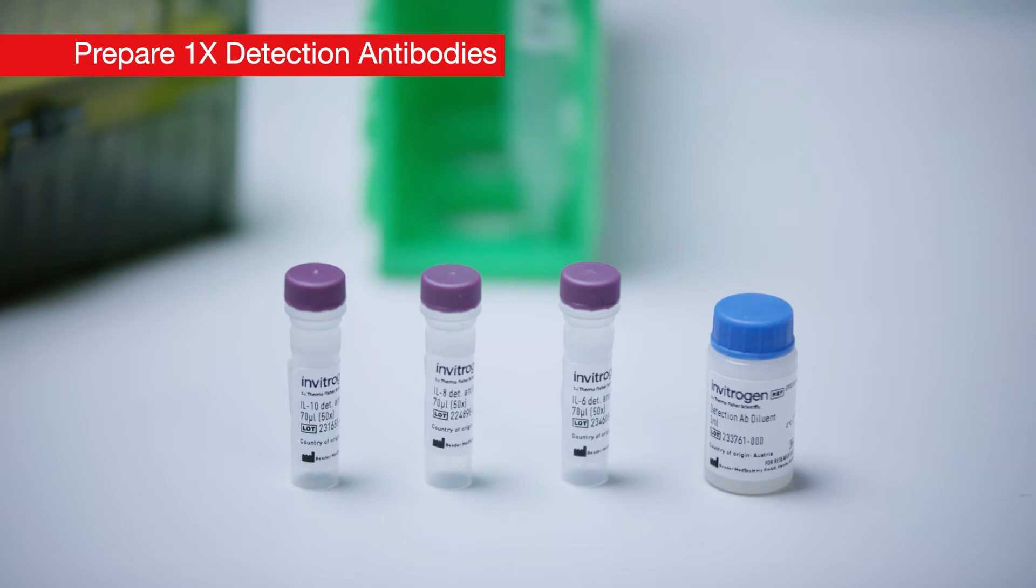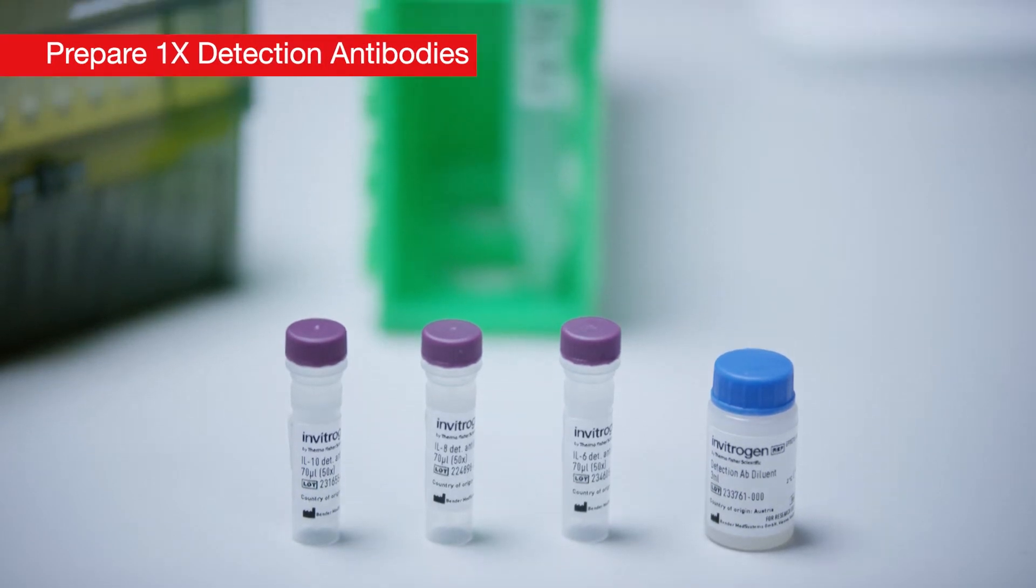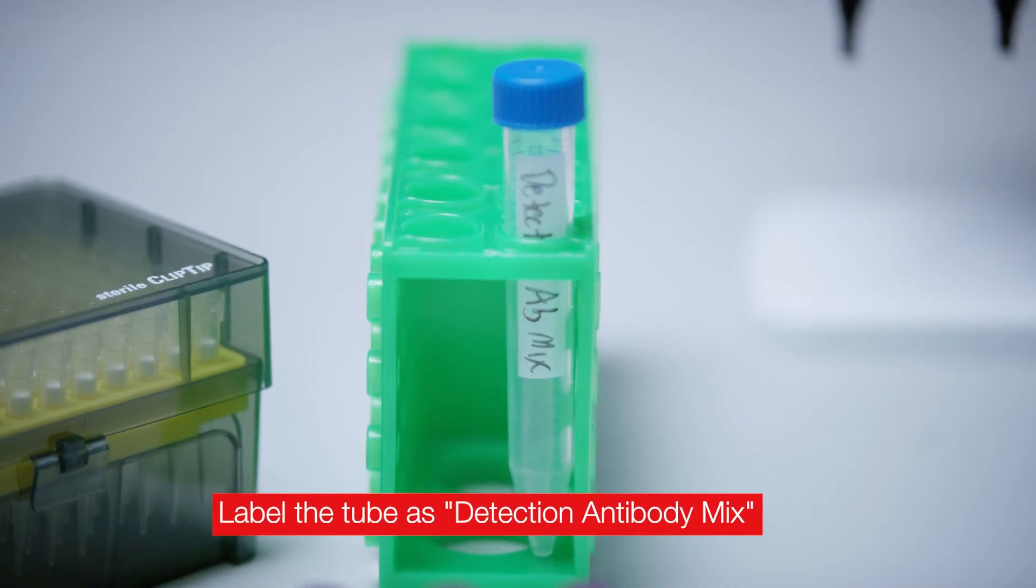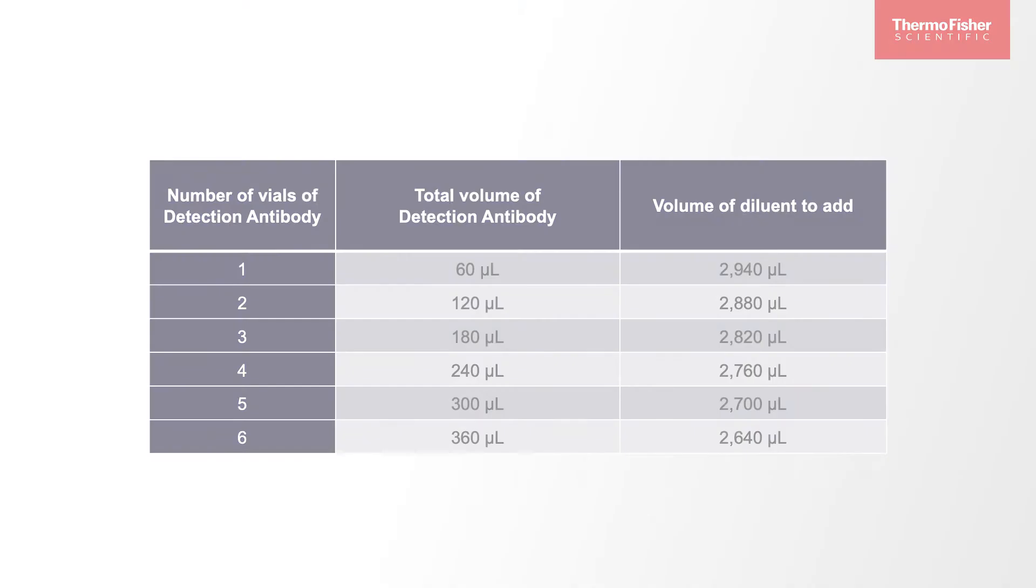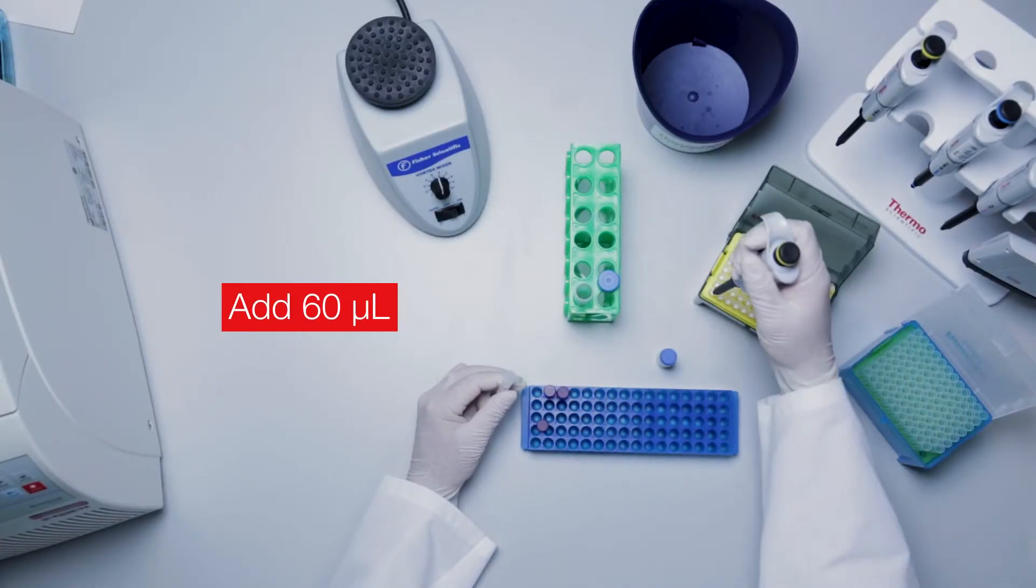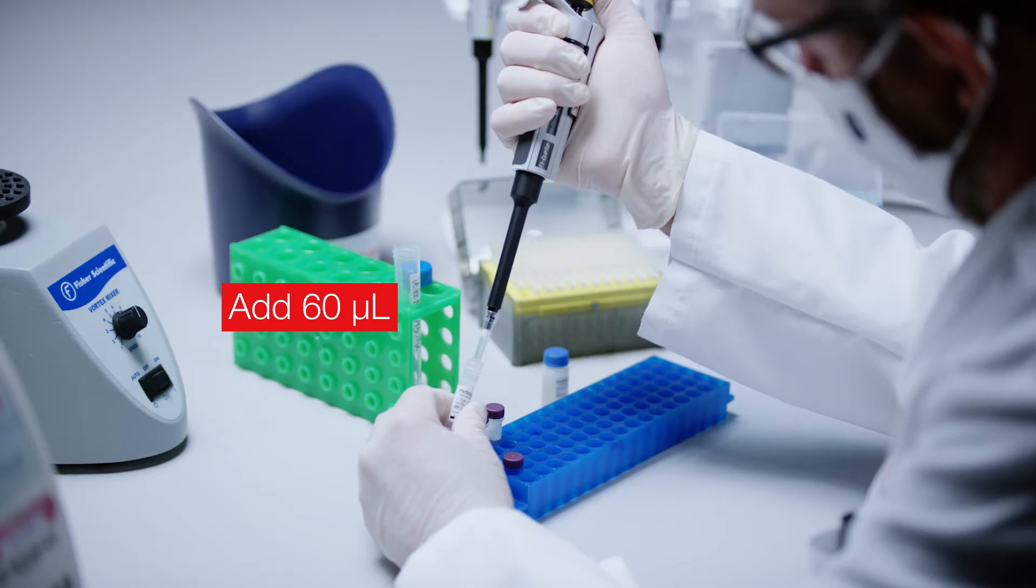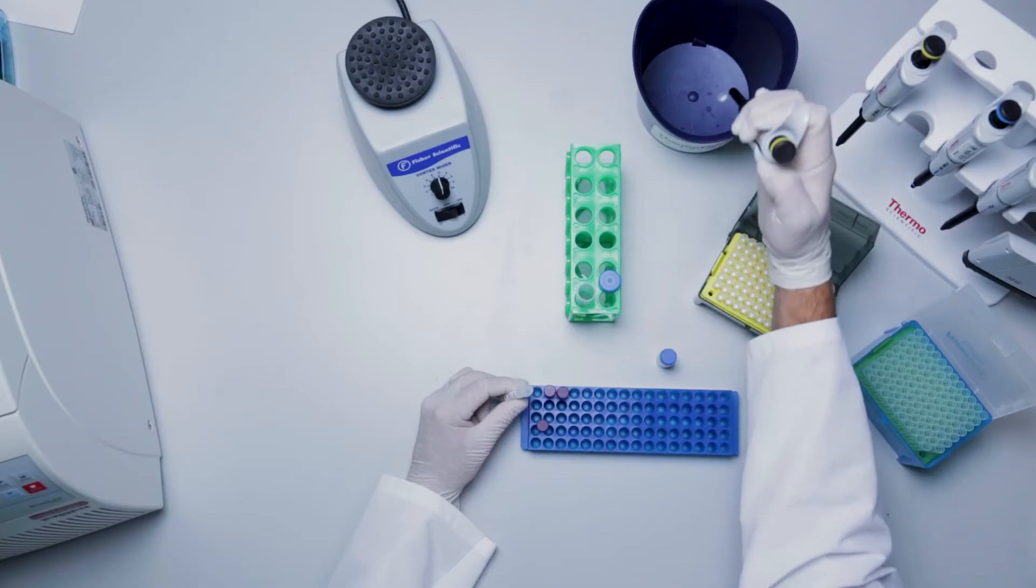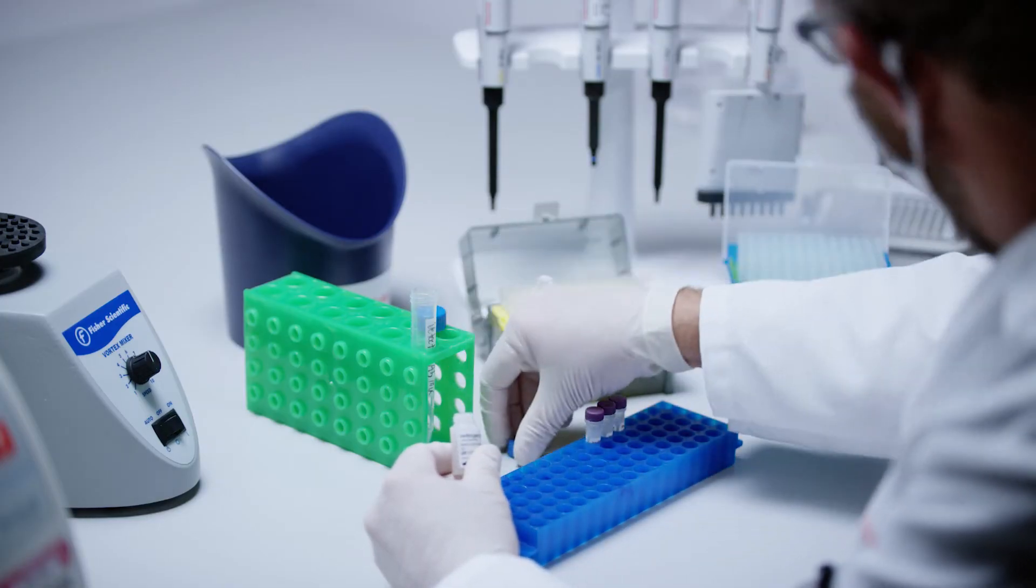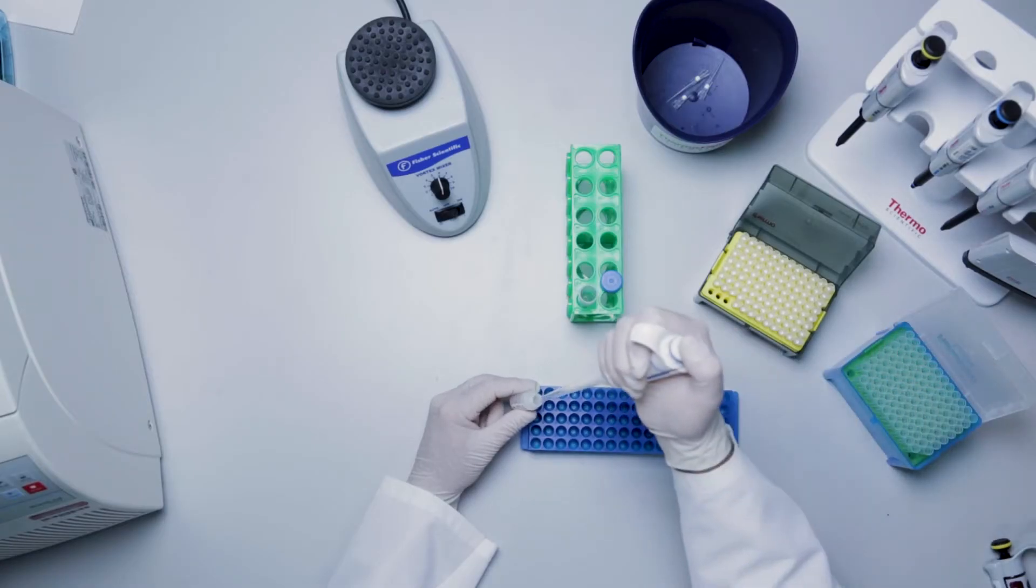The detection antibody in the simplex kit is provided at a 50x concentration. Label a 15 milliliter tube as detection antibody mix. Use the provided table in the user guide to check the needed volumes for a full 96 well plate. Scale accordingly if using a partial plate. Add 60 microliters of each detection antibody concentrate to the labeled tube and raise the volume to 3 milliliters using detection antibody diluent if using a full 96 well plate. Otherwise, adjust the volume accordingly.